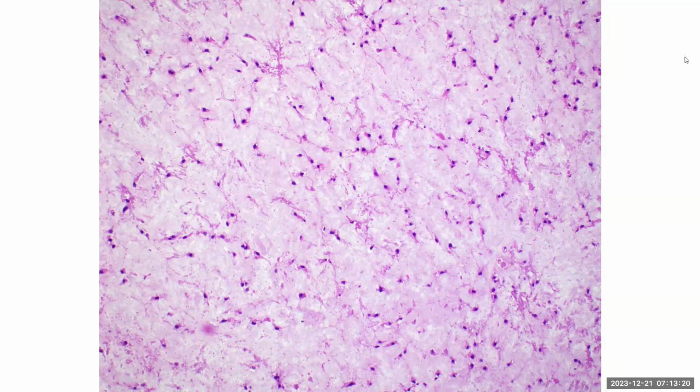So I would think of a chondrosarcoma, and there are these occasional examples of double nuclei on the right upper quadrant. There's a cell with two nuclei essentially. Is there any other picture?